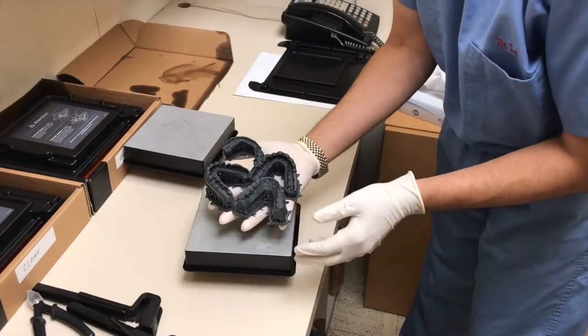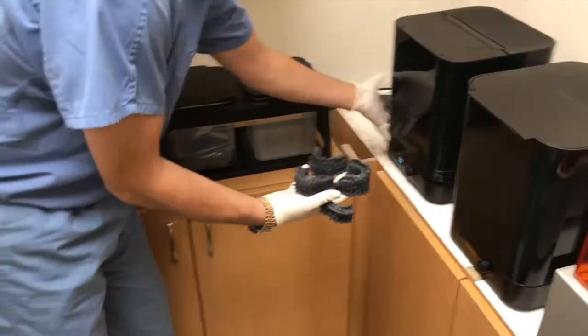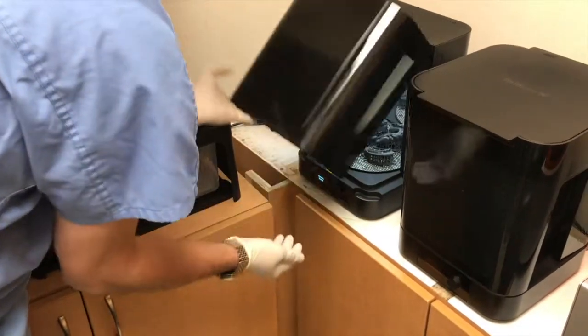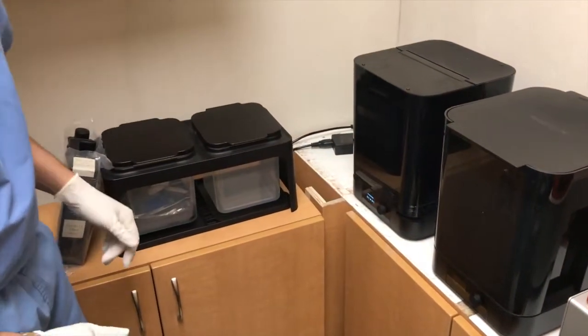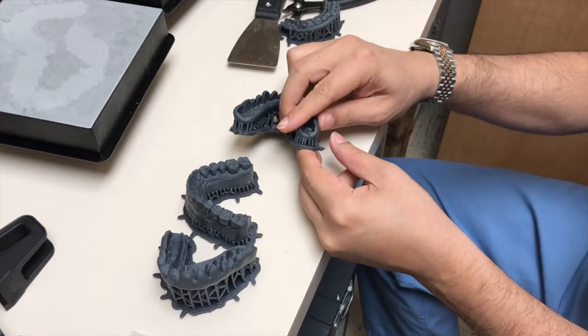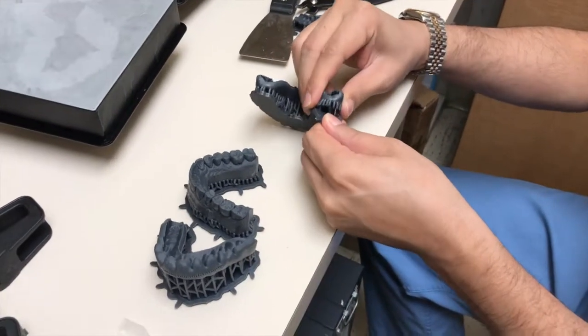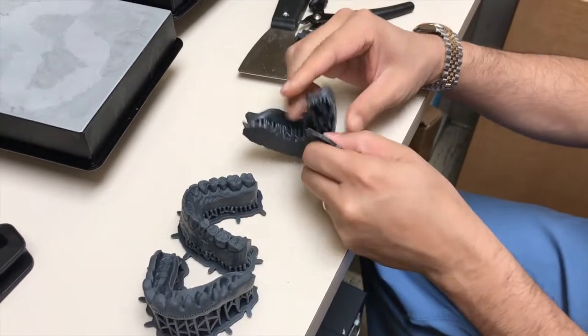This goes back in the curing unit for another 15 to 20 minutes to allow complete polymerization. Because it's a flexible material, you can just pull off the base from the supports.